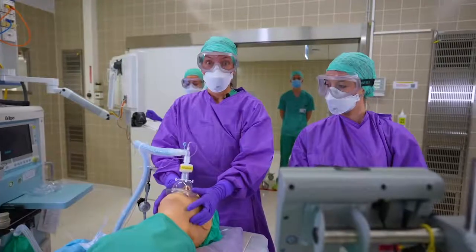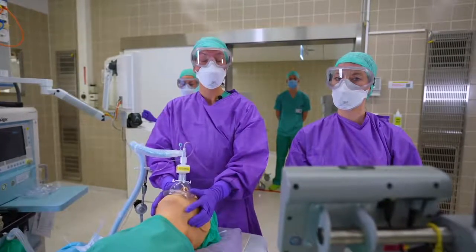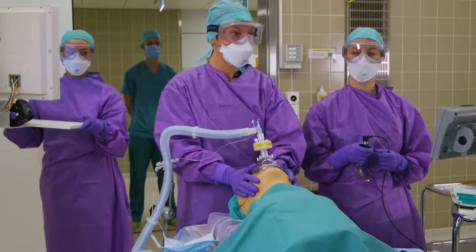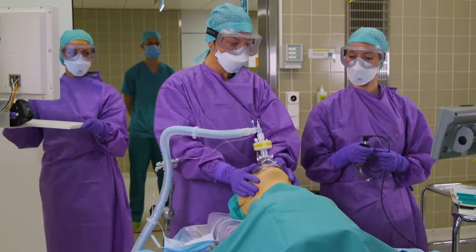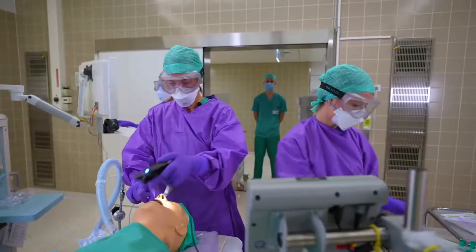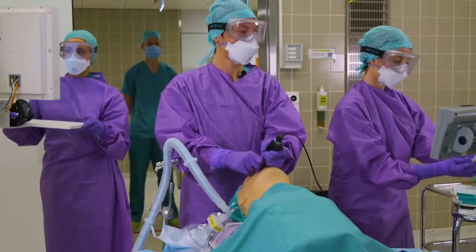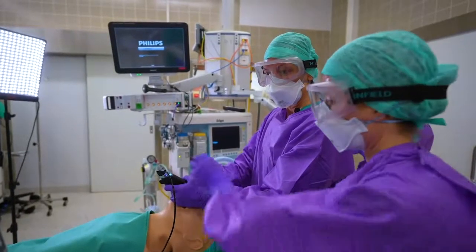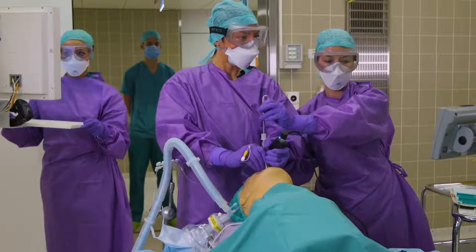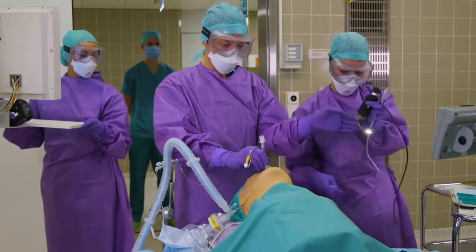After a thorough pre-oxygenation, we are starting our rapid sequence induction. RSI is used to avoid bag-masking the patient for prevention of aerosolization. Avoiding coughing with a thorough relaxation is also of utmost importance. We induce the patient, and our patient is paralyzed. We are now intubating the patient with a video laryngoscope, utilizing an endotracheal tube with a stylet in place. The endotracheal tube is now in place. It's important to inflate the cuff before ventilating the patient.